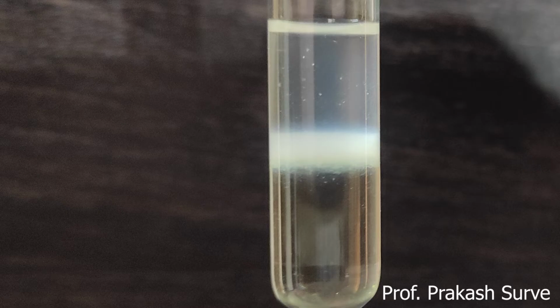You can clearly observe this, the white cloudy ring. This is floating in between the two liquids.